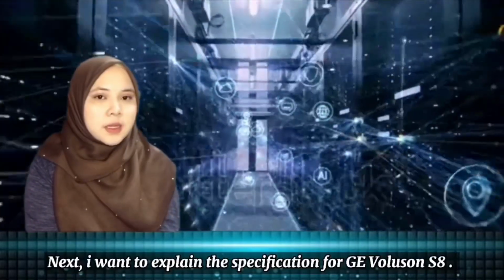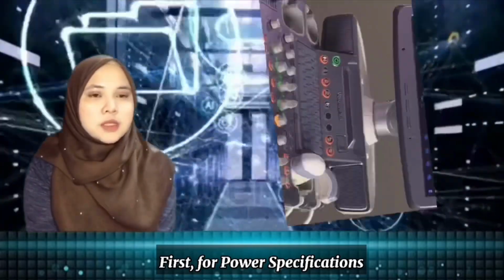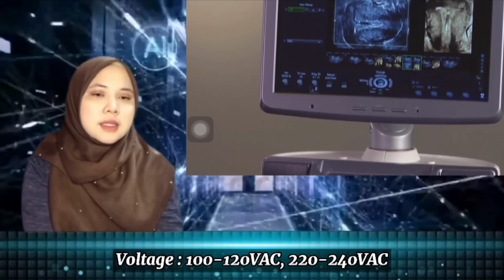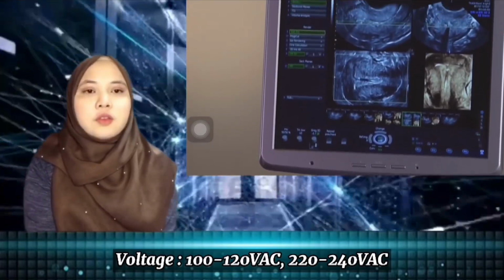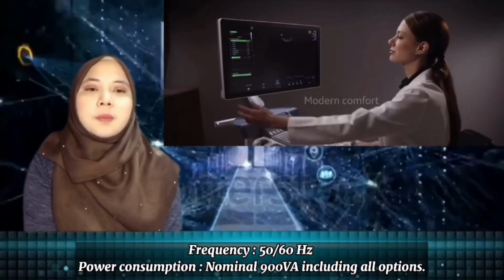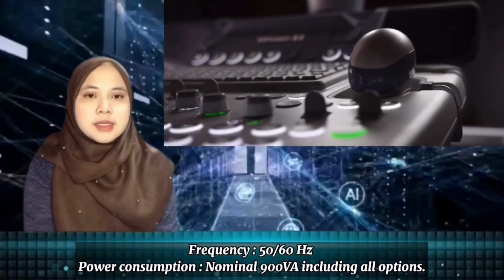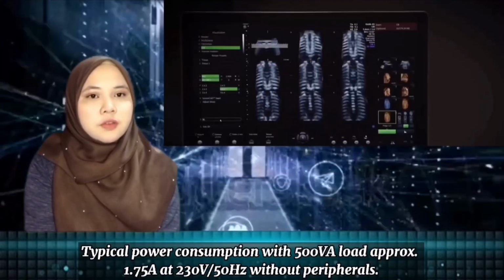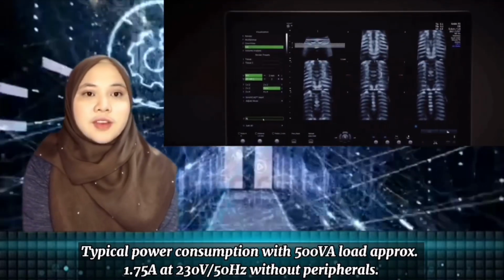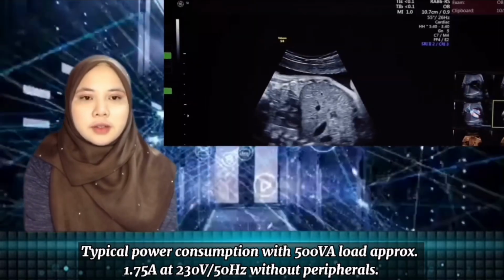Next, I want to explain the specification for the GE VOLUSON S8. First, for power specification, the voltage is 100 to 120 volt AC, 220 to 240 volt AC. The frequency is 50 to 60 Hz. The power consumption is nominal 900 volt ampere including all options. The typical power consumption with a 500 volt ampere load is approximately 1.75 ampere at 230 volt with 50 Hz without peripherals.